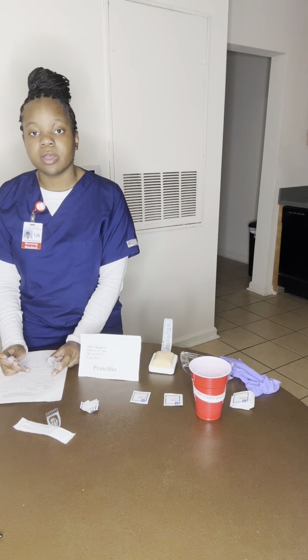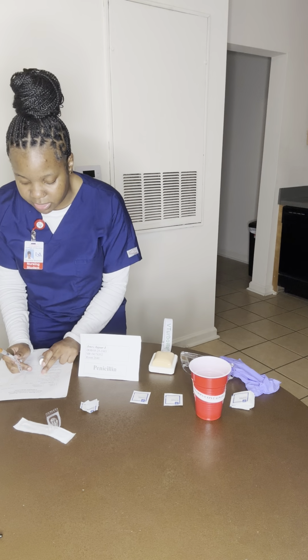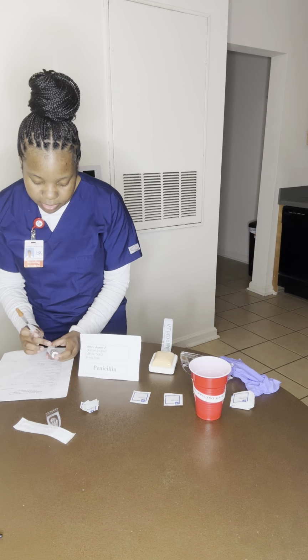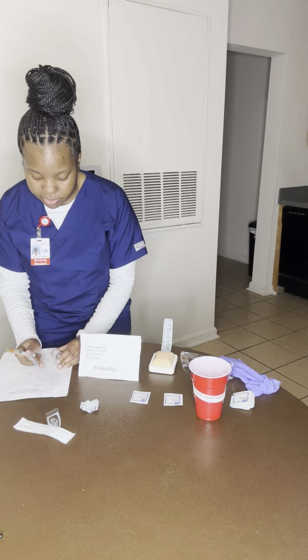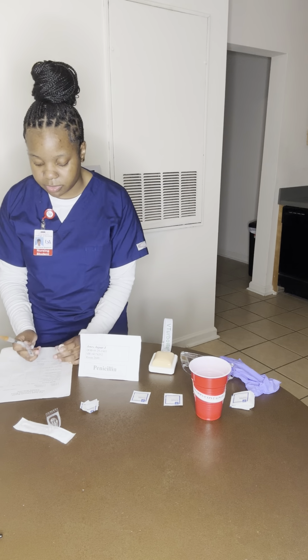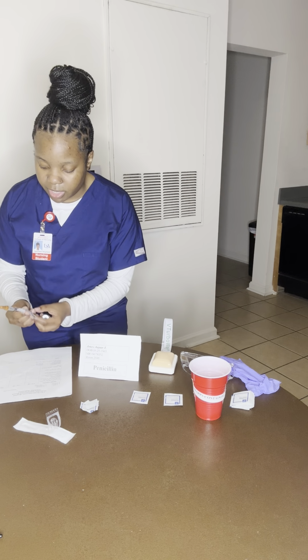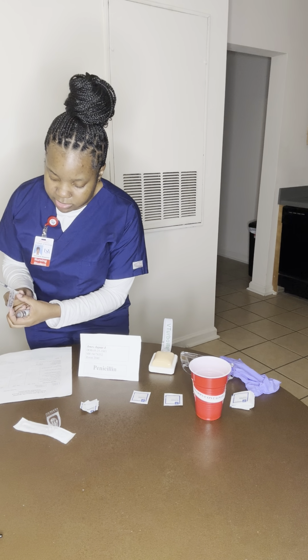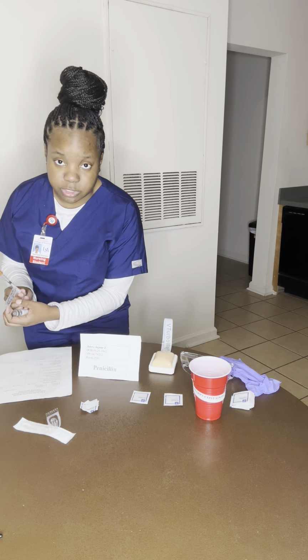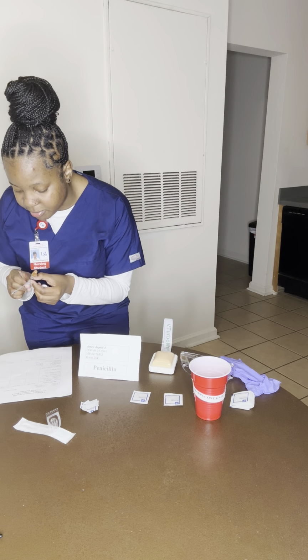So now I'm going to do the right dose. Heparin is given at 5,000 units subcutaneously every 12 hours. And we know that this heparin is 10,000 units per milliliter. We know that 5,000 units is half of 10,000 units, so half of 1 milliliter would be 0.5 milliliters. On here the patient is given 5,000 units, which is 0.5 milliliters, and we can see that there is 0.5 milliliters in the syringe.